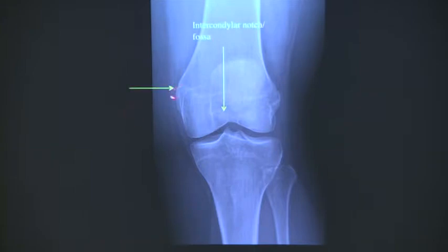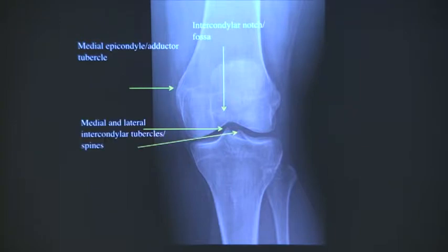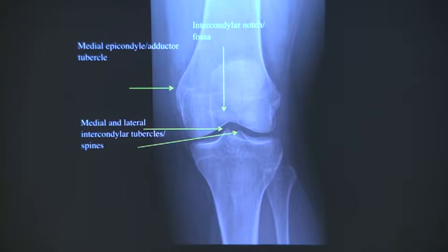This is the medial epicondyle - or adductor tubercle, because it's the attachment site of the adductor magnus. How do you call this structure here? That's the intercondylar eminence - lateral intercondylar tubercle or spine. These are the medial and lateral intercondylar spines. Be careful because this is not the attachment of the ACL and PCL. They are usually avulsed when there is an avulsion of the ACL.